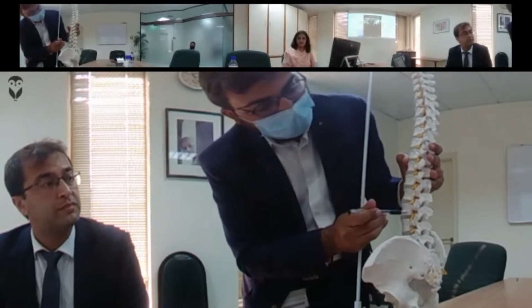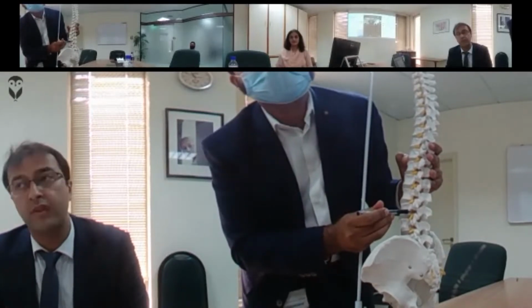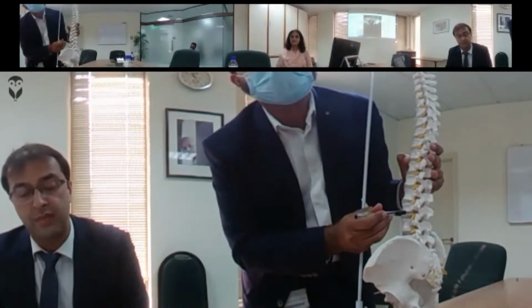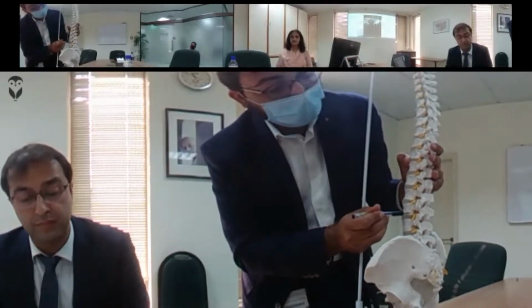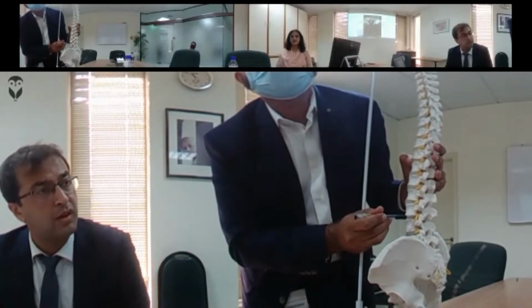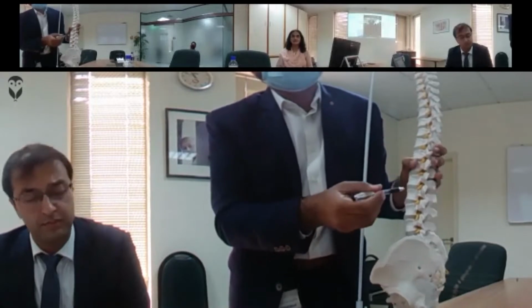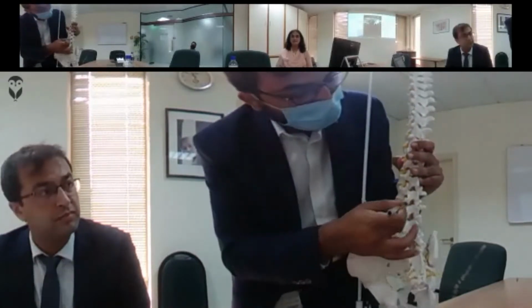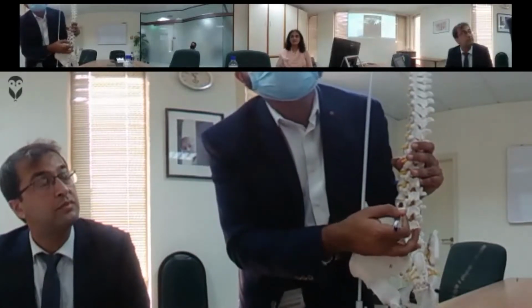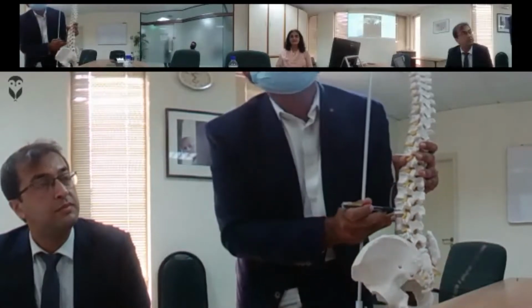Okay, so that's the way you're not going too ventral and hitting the thecal sac or the epidural or the dura mater, and at the same time, if you're in the upper one third, you're not hitting the nerve root there. Sure. So upper and outer one third. But at the same time, if you're going too far and your needle is too far out of the pedicle, in the AP view it should be at 6 o'clock. It's a little out. Yeah, you have a little room to move it in.